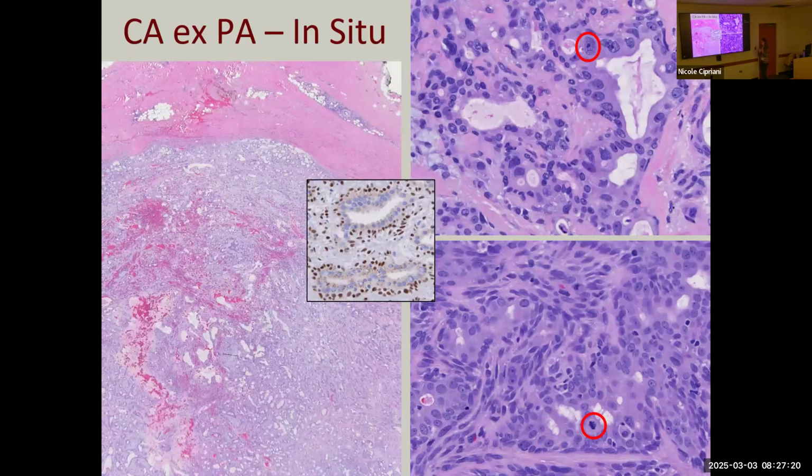It's thought to start, especially the salivary duct carcinoma ex PAs, within the ductal system of the PA, right? So remember we saw those bilayered ducts. You can see that the outer layer is a myoepithelial cell layer, and it stains with P63, P40, and the inner layer is negative. It is in those inner layer cells that start to develop nuclear atypia, pleomorphism, mitoses, whatever. They get some kind of additional genetic hit, right? And they start to transform. If it's resected in this manner before it has invaded out, the prognosis is extremely good.